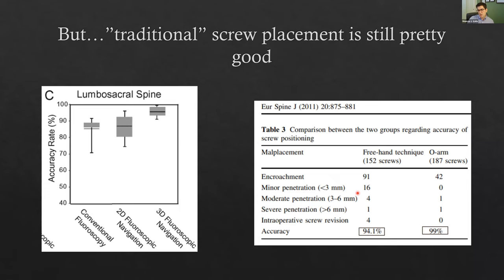And I think the key part, as this technology is developing and we start researching more and more, is the intra-op and the post-op revisions, right? Because that will be the differential. If you're having zero intra-op revisions versus four, this is time. Again, still the same surgery, but it is time.